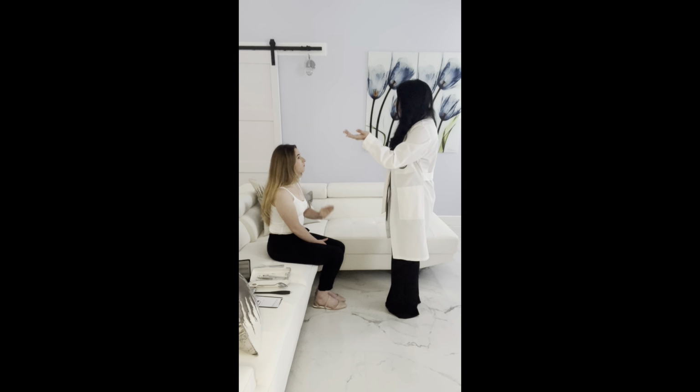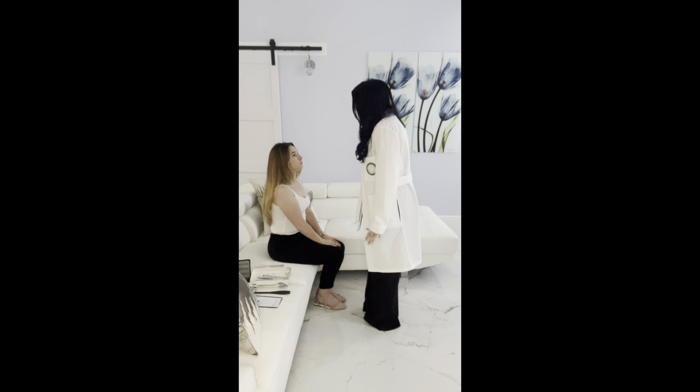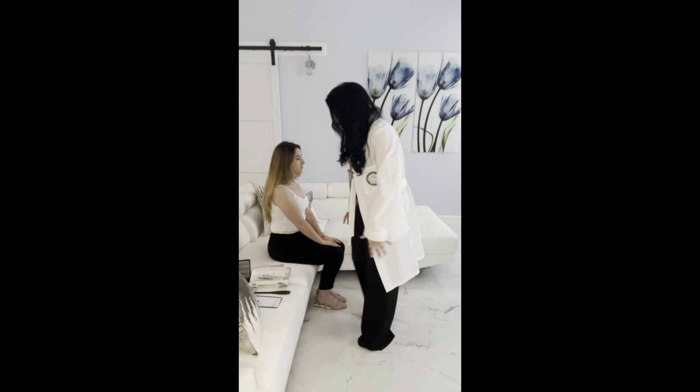All right, now cover your right eye, and I'll cover my left. And I'm going to start up here again. Stop. 3. Perfect. I'm going to come from down here. Stop. 2. Perfect. All right, the next thing that we're going to do is I am going to do a fundoscopic exam, so I'm going to shine another light into your eyes.